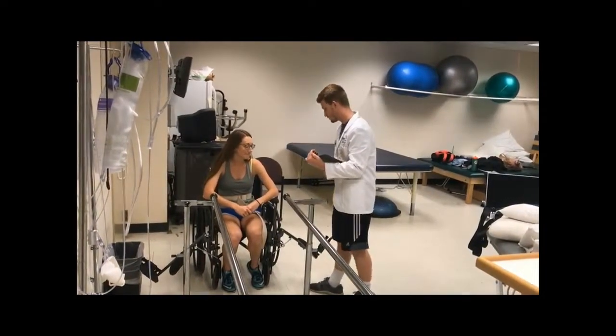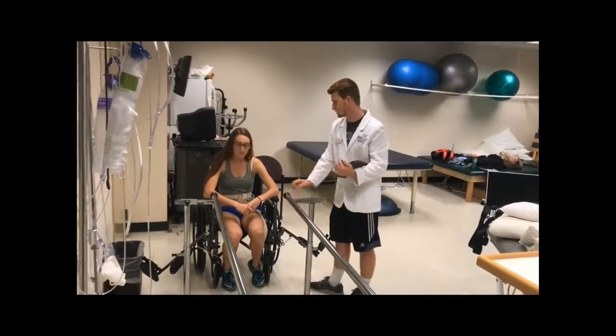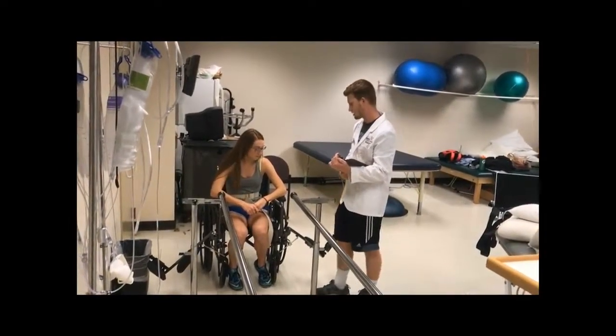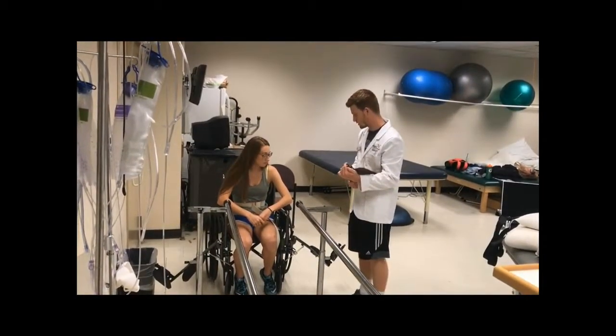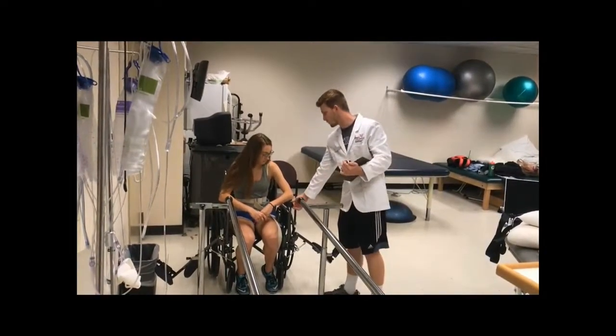So what we're going to be doing today is you're going to be standing up from your wheelchair, and then once you're standing, you're going to grab these bars in front of you because we're going to be doing some exercises on the bars. When you position your feet, you can either stagger them with your more able leg in the back, or you can have your feet parallel to each other. Then when you push up from the chair, you're going to push up on these armrests.